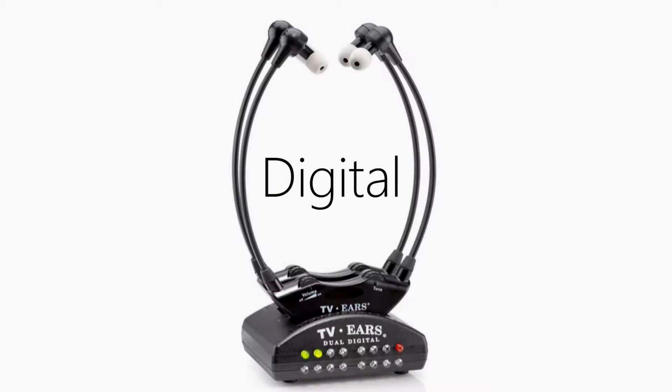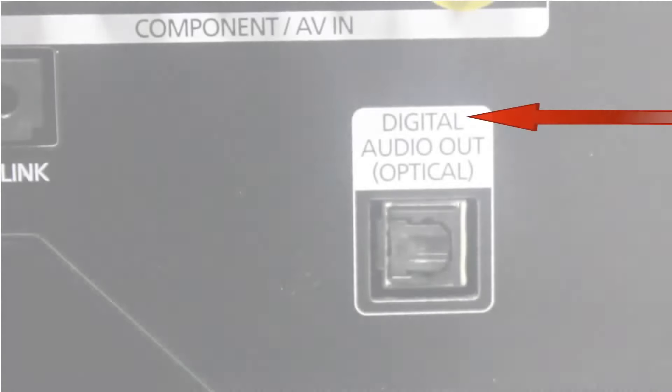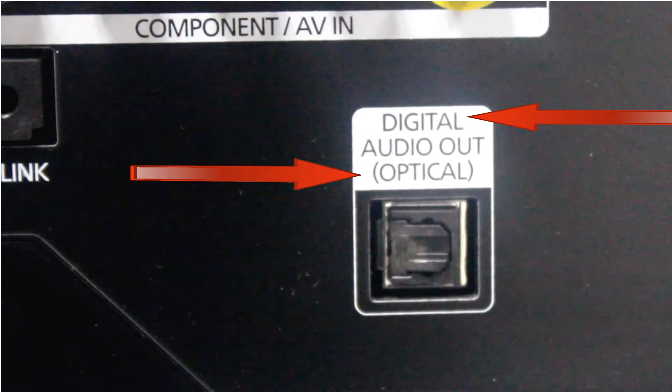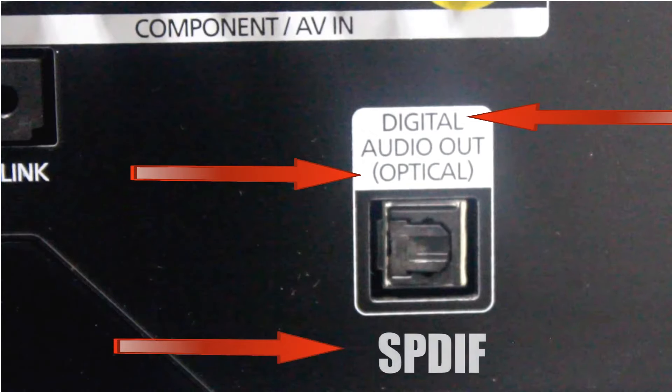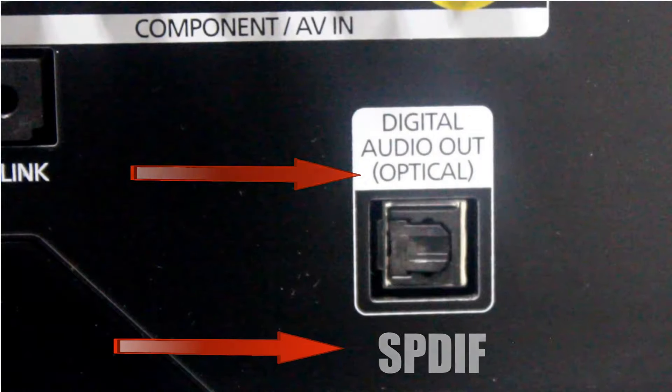If you have the digital model of TV ears, use the optical audio cord and plug into a spot labeled as digital audio out, optical audio out, or rarely it may be labeled as SPDIF. Both of these options should let you hear sound out of both the television and the TV ears.